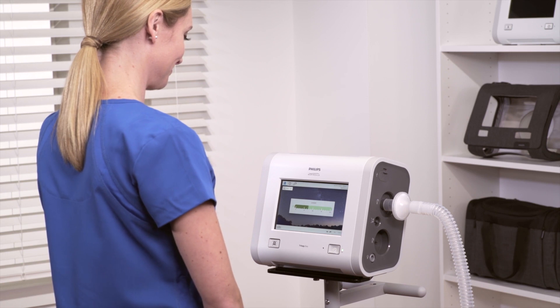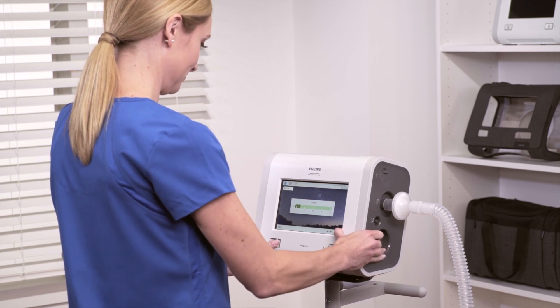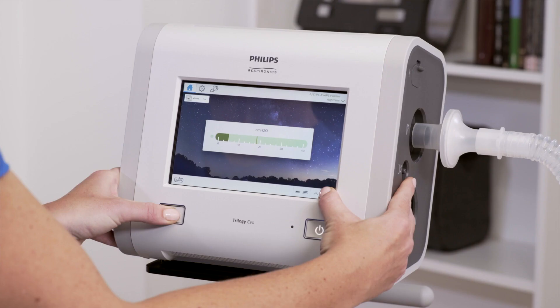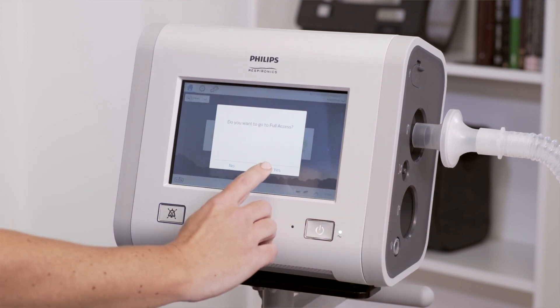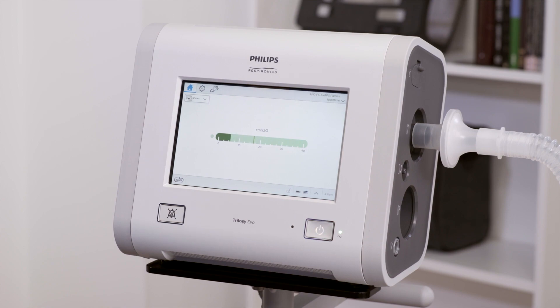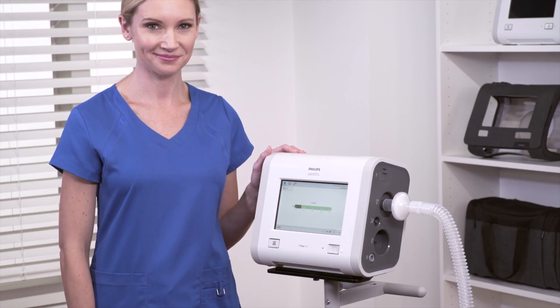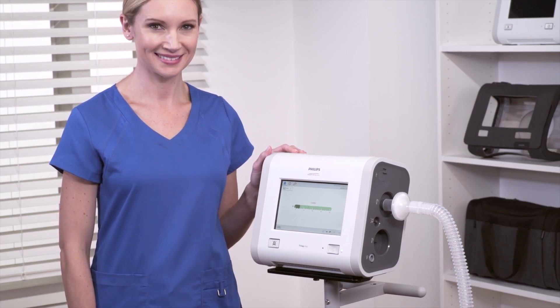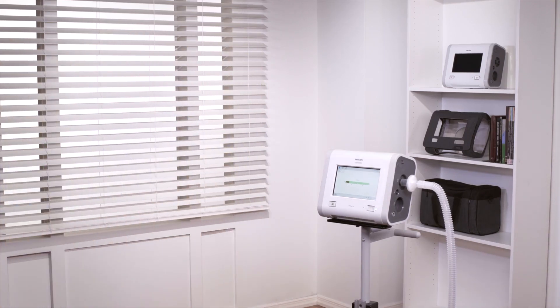To go to temporary full access, press and hold the digital clock and then the Alarm Silence button and keep holding them together for five seconds. A confirmation pop-up window will appear — follow the instructions. Taking the time to become familiar with Trilogy EVO's functions can help you deliver quality, efficient clinical care and enhance patient comfort.